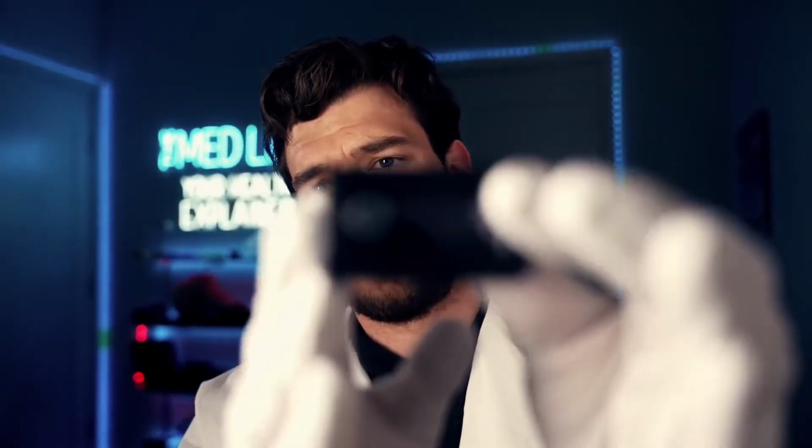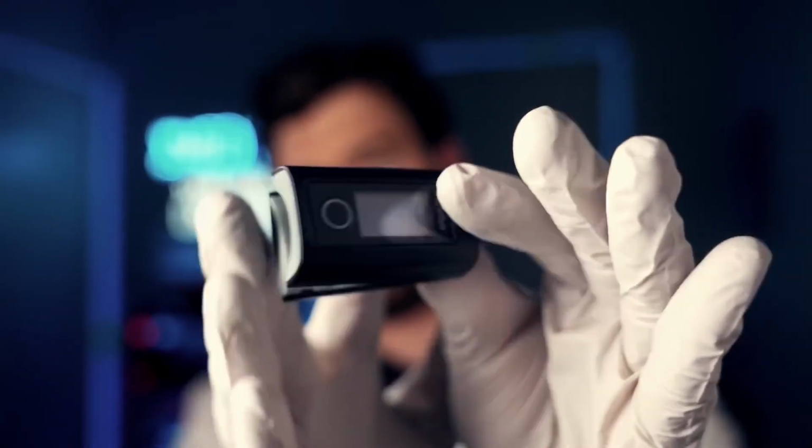We're going to get a pulse reading here to start getting some vital signs. This will give me your oxygen as well. If there was something like a pulmonary embolism, you'd be expected to have a low oxygen saturation and also a fast heart rate. So I'd be able to tell by using this pulse oximeter to start to get some of those vitals. So I'll put your finger in here if that's okay. Great. Okay. And we'll let this do its job here. It just takes a few moments to get a reading.